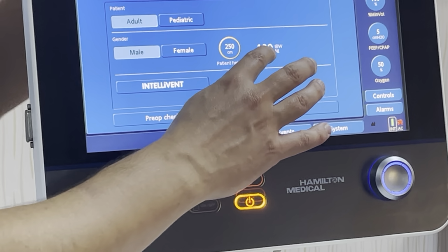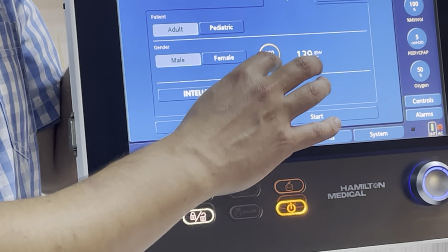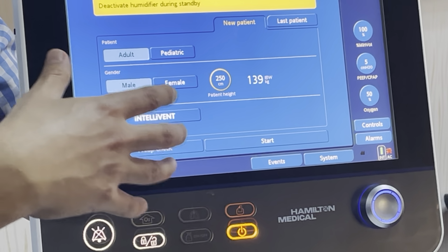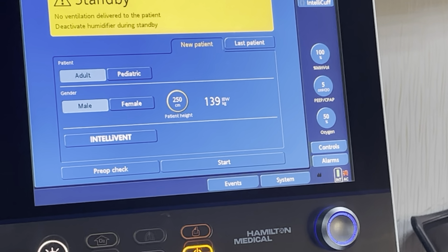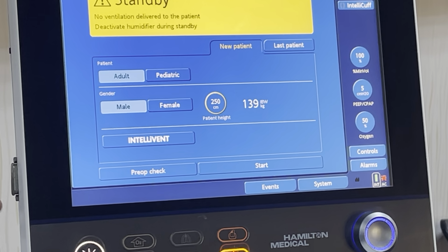Normally we work with ideal body weight, not the real weight, but we have to set the patient height. Why? Because the structure of the airway, the length, depends on the height of the patient, not on the weight. So we use the ideal body weight just to calculate the volume required for the patient. Okay, so the machine can ventilate a range of categories of patients.